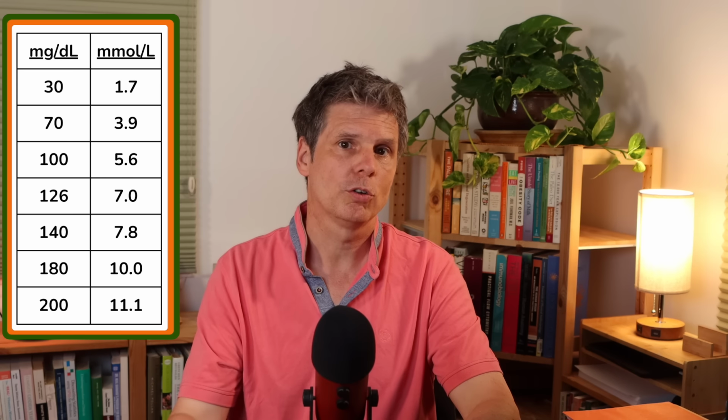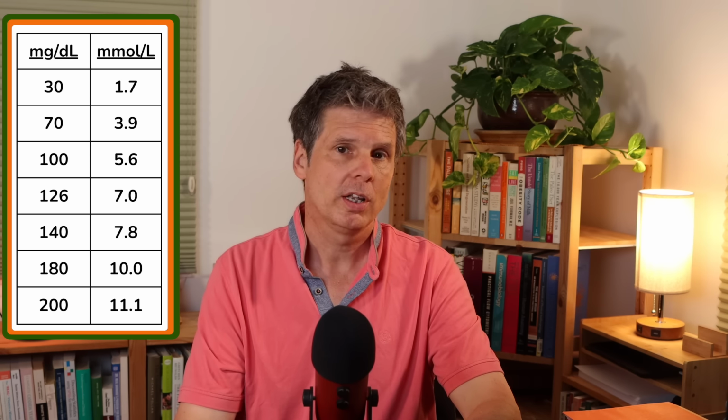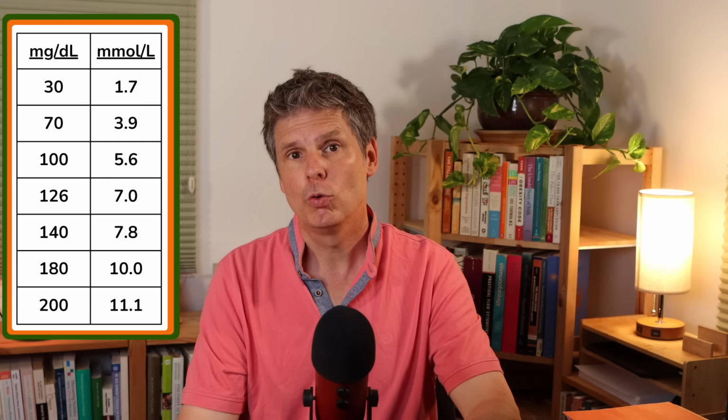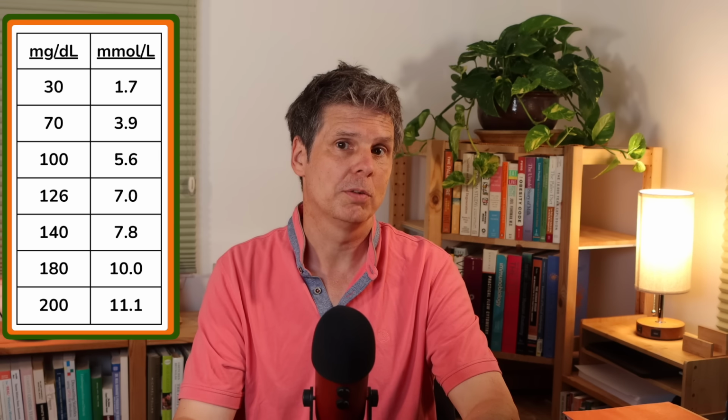Look at your baseline glucose levels before they start to rise. If that number is consistently higher than 100 milligrams per deciliter, I suggest you discuss this with your doctor. Then take a look at your typical glucose levels exactly 2 hours after you started eating a meal.